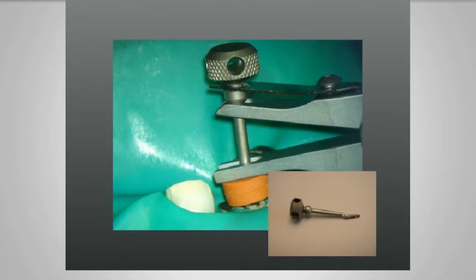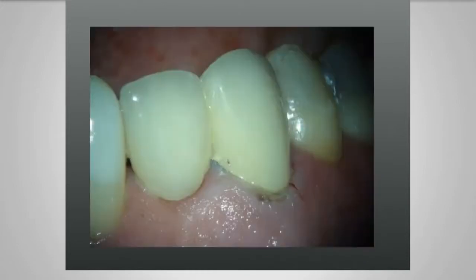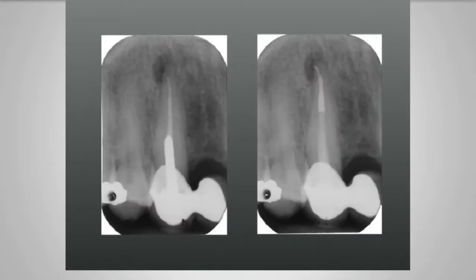Once the tooth has then been retreated non-surgically, I put it all back together again. This is the crown and cantilever bridge re-cemented using a fibre post, and you'll see that in this slide. So this is the pre-operative radiograph here with the cast post in situ, root filling. This is my root canal retreatment, non-surgical, fibre post, and the restoration re-cemented using dual cure composite.